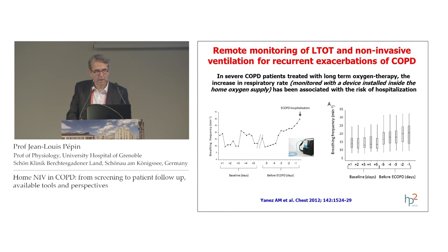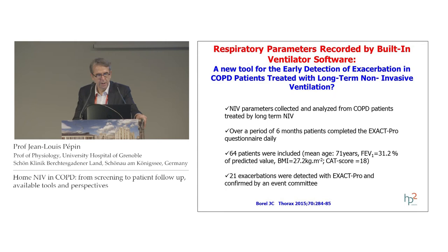The first idea outside the field of non-invasive ventilation was to take advantage of the increase in respiratory rate before the exacerbation in people with long-term oxygen therapy, to predict and to treat this exacerbation early. Actually, we did a study with Jean-Christian Borel, recently published in Thorax, and we looked at the NIV parameters collected with different brands of NIV device.